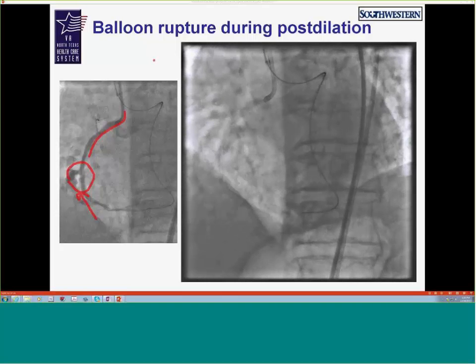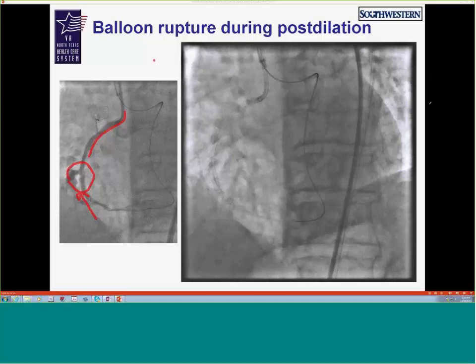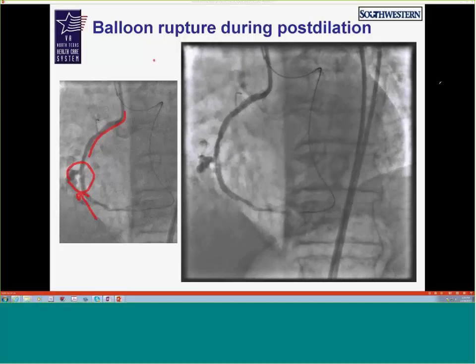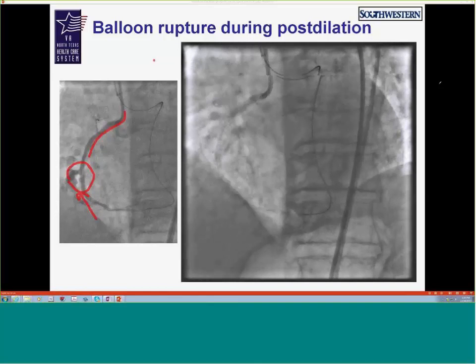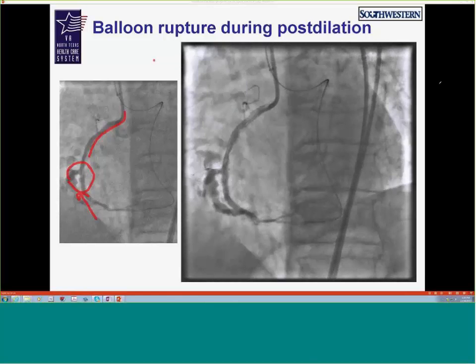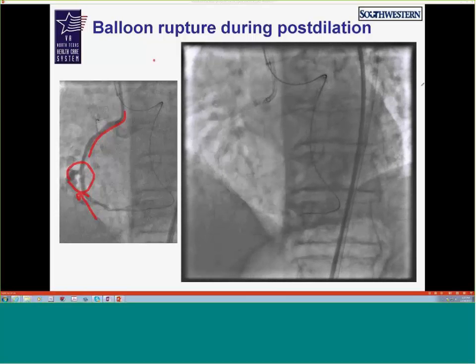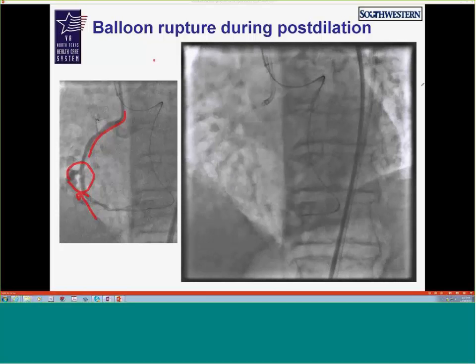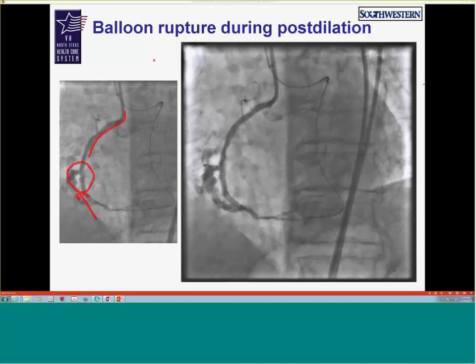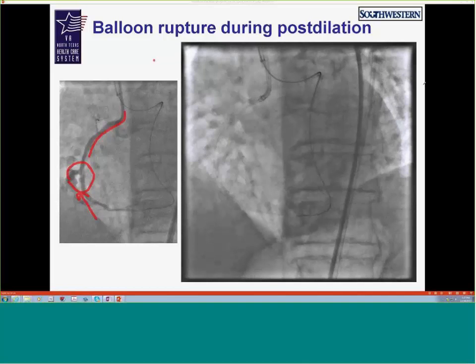Well, I suppose you could put a little tube into that. That's a pretty big neck, so you could put a tube into that neck and consider putting some coils in. Oh, into the perforation side. I see what you're saying. Yeah, I guess that would be an option. To be honest, it didn't cross my mind at the time, but that sounds a reasonable option. Although the space looks a little generous. But I guess that's something definitely we can do.